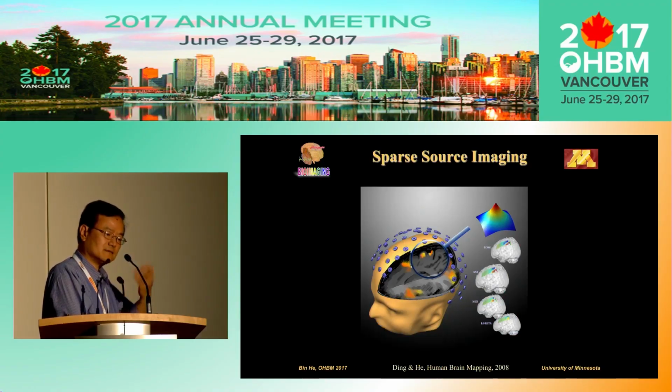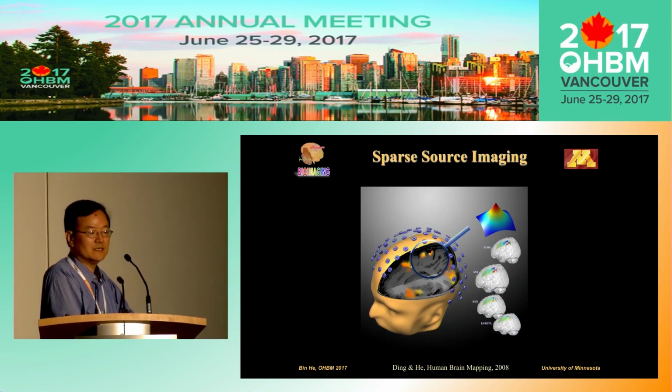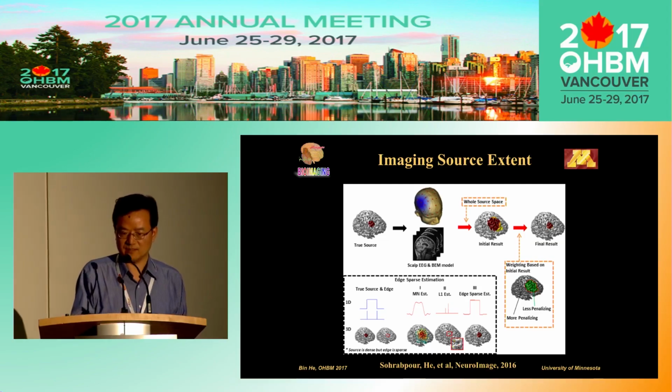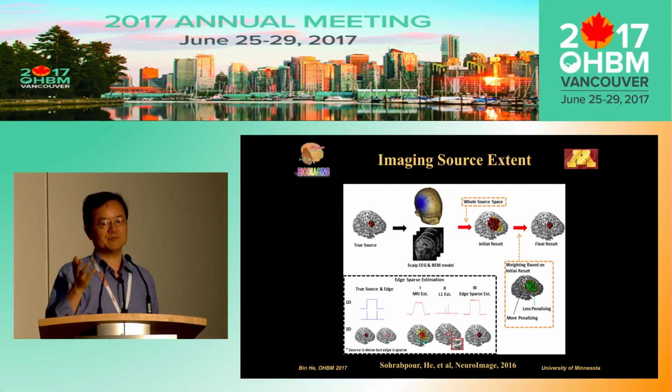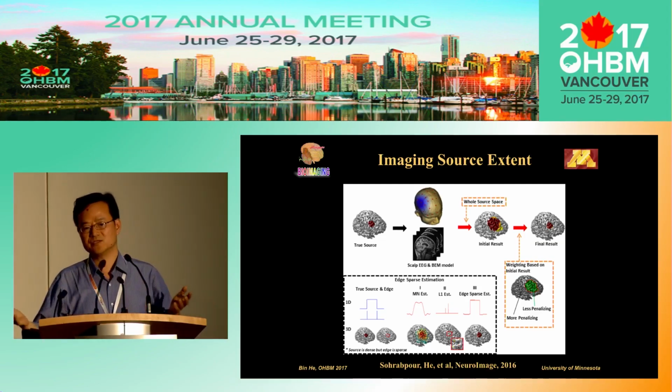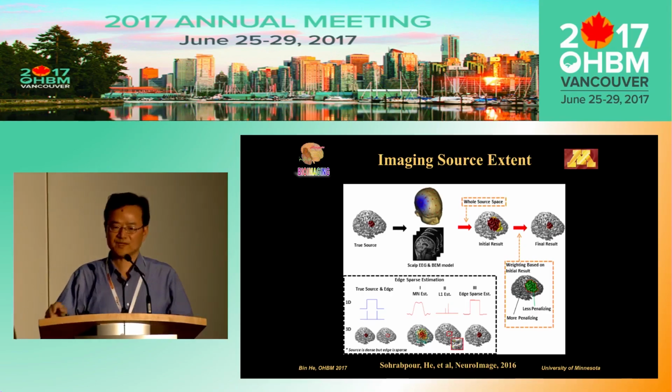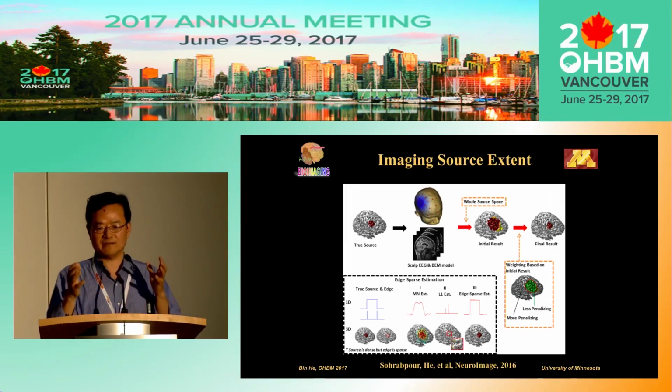And then I want to mention that some sparse source imaging has been introduced by various groups, our group included. Essentially, you try to take advantage of signal processing. I see from time to time people in different imaging communities say, okay, EEG and MEG is beautiful, but you cannot get extent; you can only get a center of gravity.